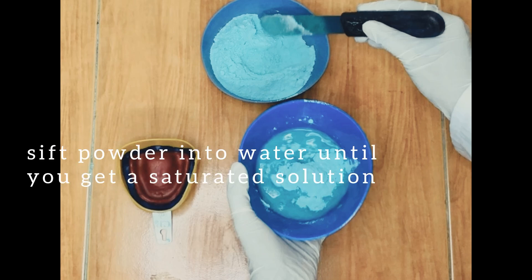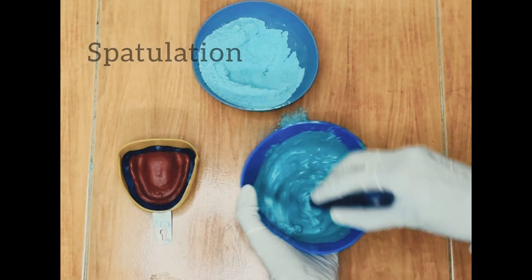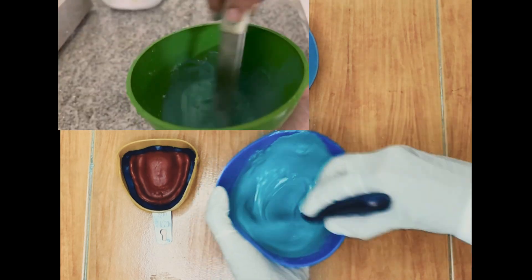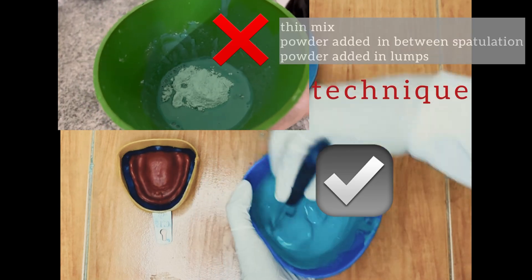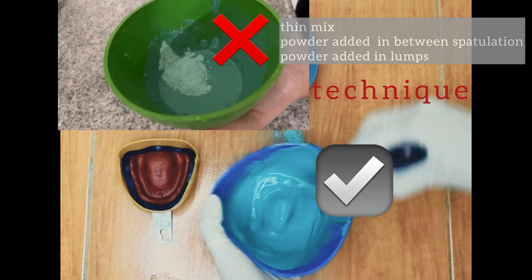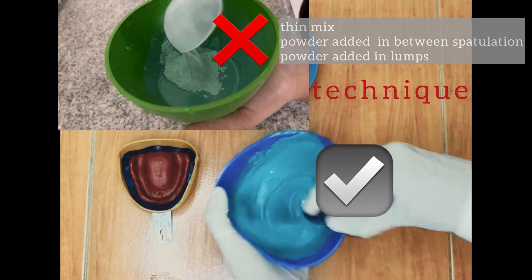Spatulation can be done by hand or by using a mechanical spatulator. If your proportions were guessworked initially, you may get a thin mix and may end up adding more powder in between spatulation. This essentially produces two mixes of plaster setting at different times, which results in a weakened product with poor physical properties.